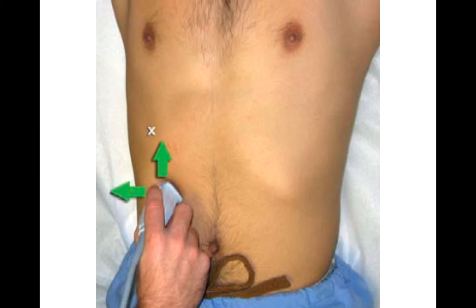To find the gallbladder, place the probe under the right costal margin as shown here, with the marker dot directed towards the patient's right shoulder or the patient's head. Sweep along the costal margin until an image of the gallbladder is found. If you're having trouble, you can have the patient take and hold a deep breath to bring the gallbladder down below the rib margin.